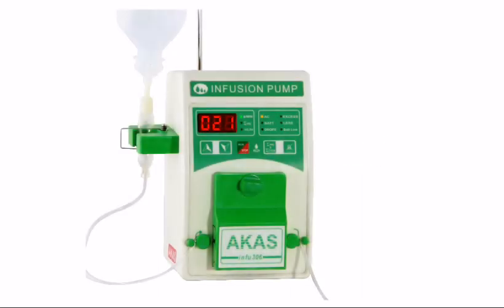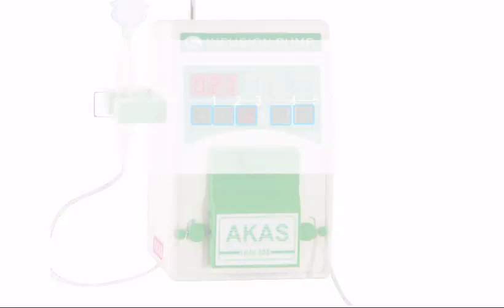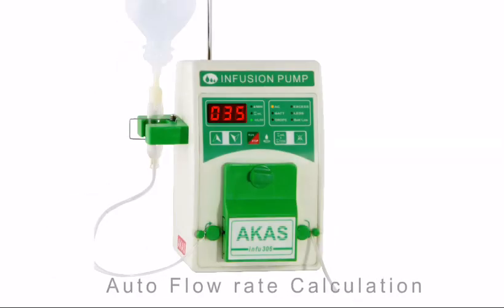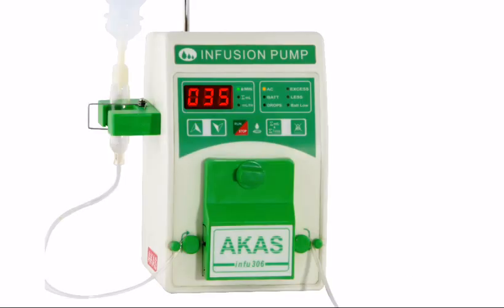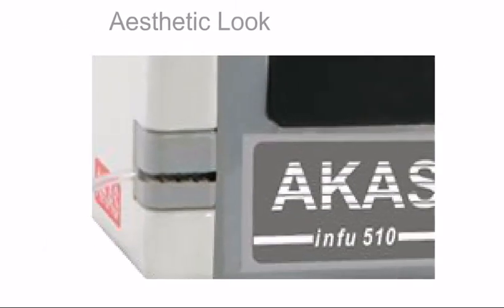Arcas Info 306 has a simple interface with minimum keys and displays for basic operation. A preset volume can be delivered uniformly over a period of set time. Arcas Info 510 is aesthetically well designed.